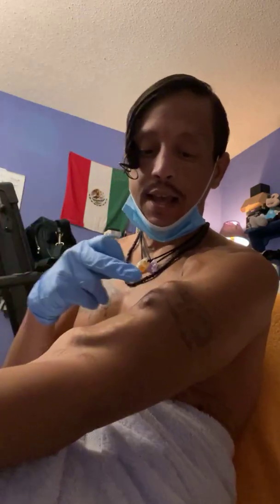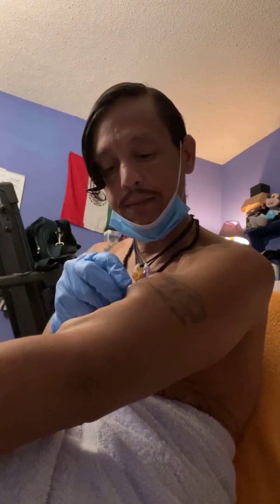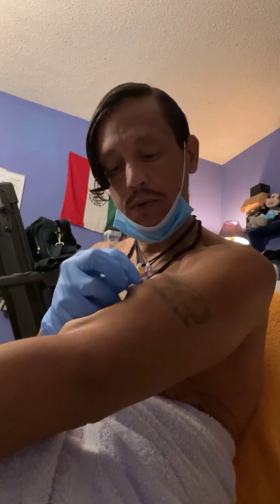There's two different ports. The bottom is the arterial line. That's where the blood comes out and into the machine. And the top is the venous line. That's where the blood, after it's been filtered, comes back in through the blue into our body. So just bear with me 1 minute while I take this off.